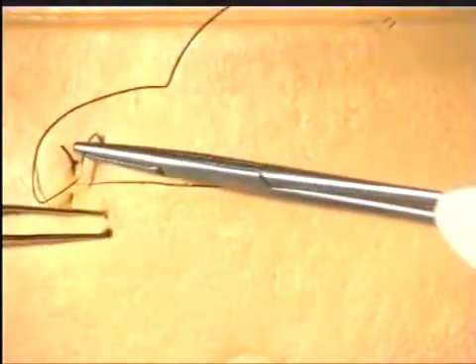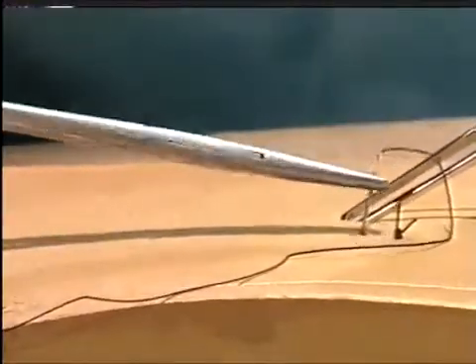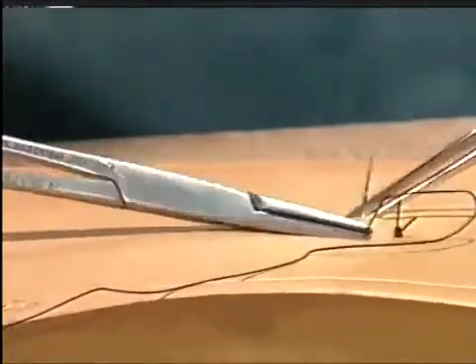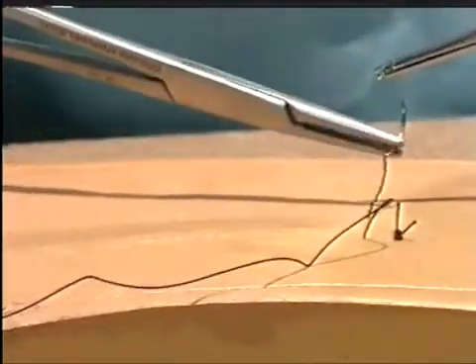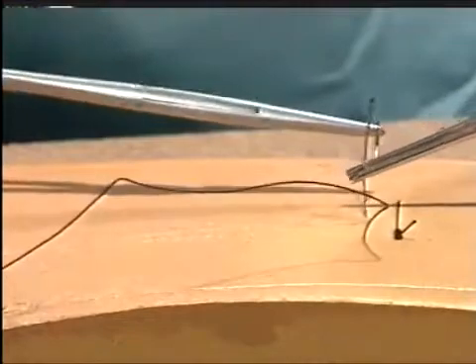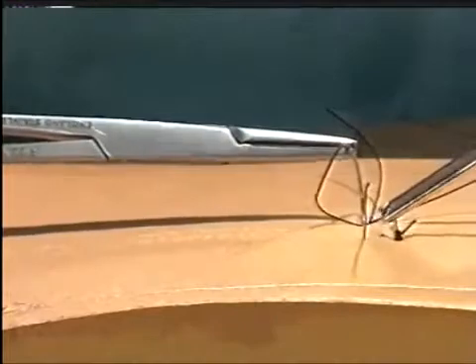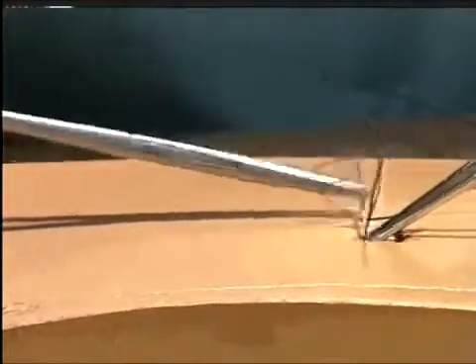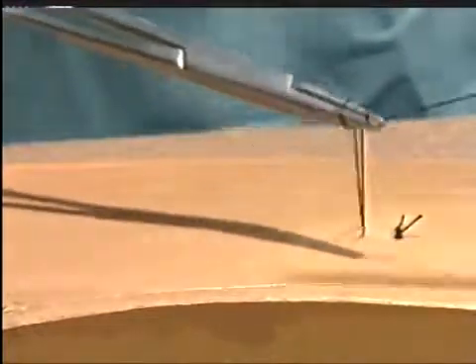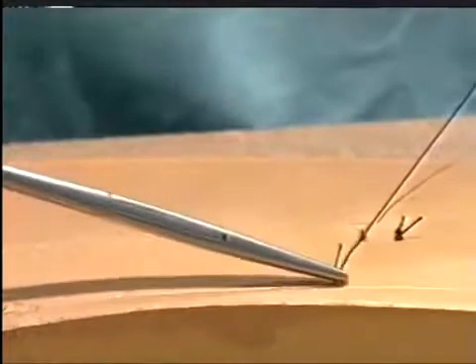A second vertical mattress suture is inserted. The suture is placed. The needle then reversed in the needle holder and then go back, taking just a few millimeters of skin edges. The knot is then tied and the suture material cut.